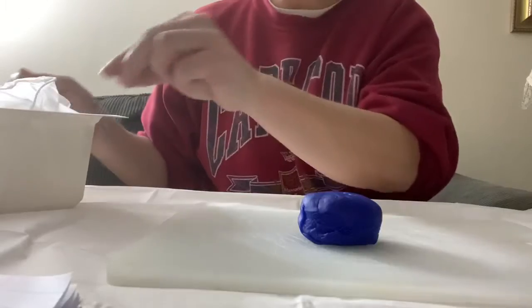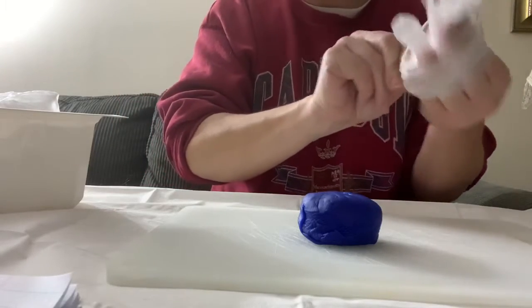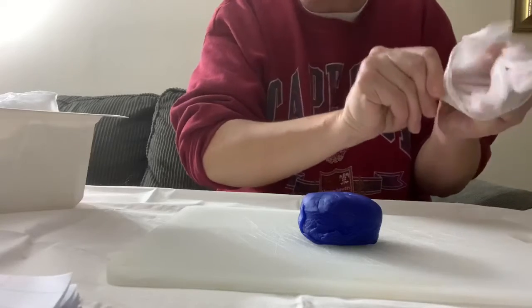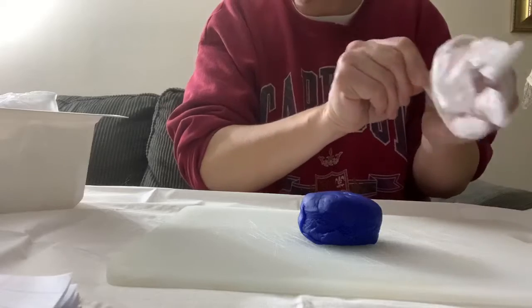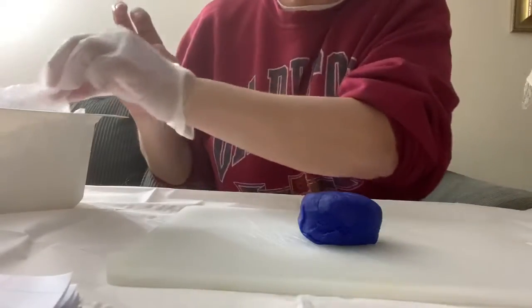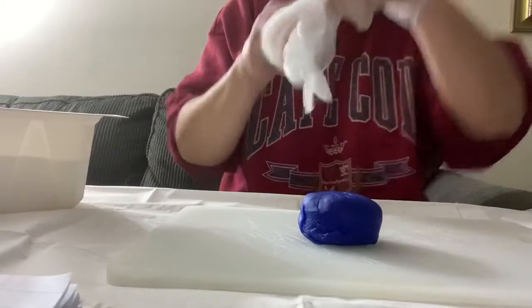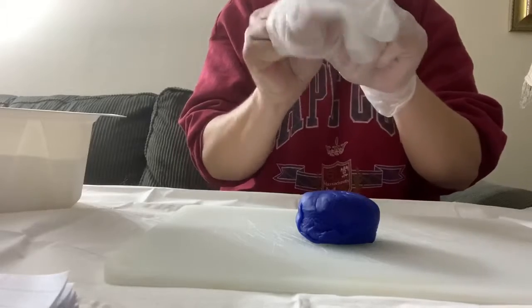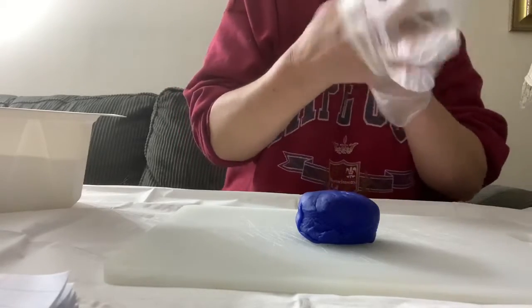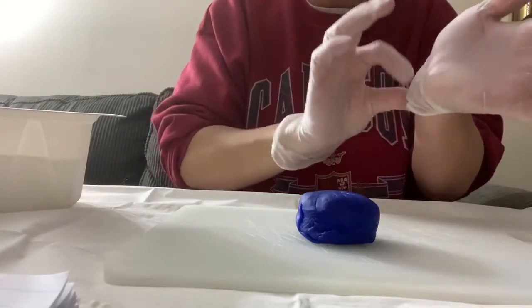I've opened that away from me. So now I'm going to put on my sterile gloves, just holding them by that cuff. And I'm going to pick up the other one, again by the cuff. So now I have my sterile gloves on.